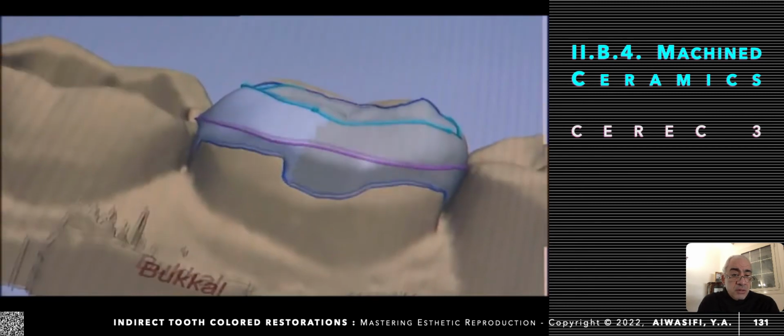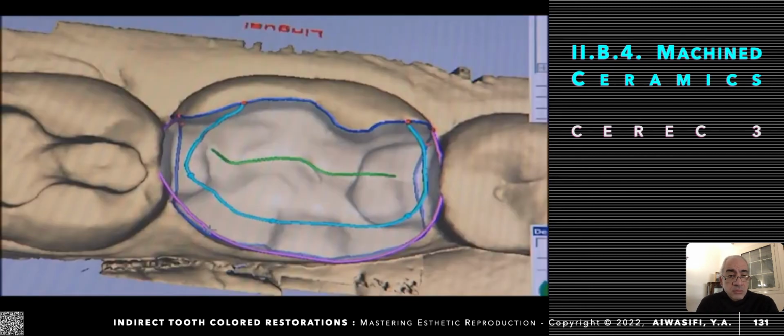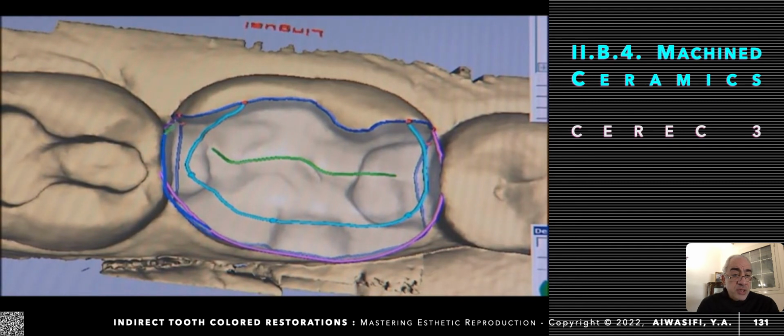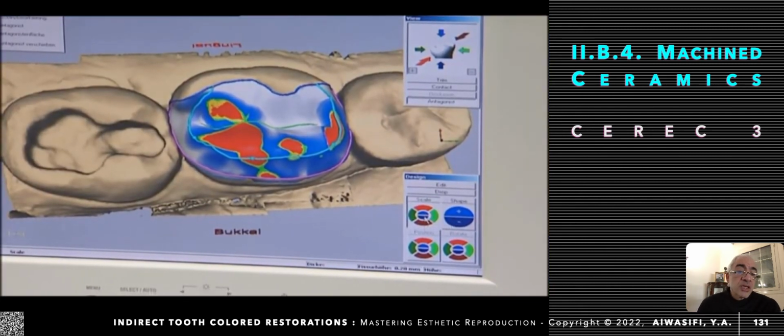Okay, it's easy to recontour it. Re-examine the thickness at different areas. Re-examine the margins again.